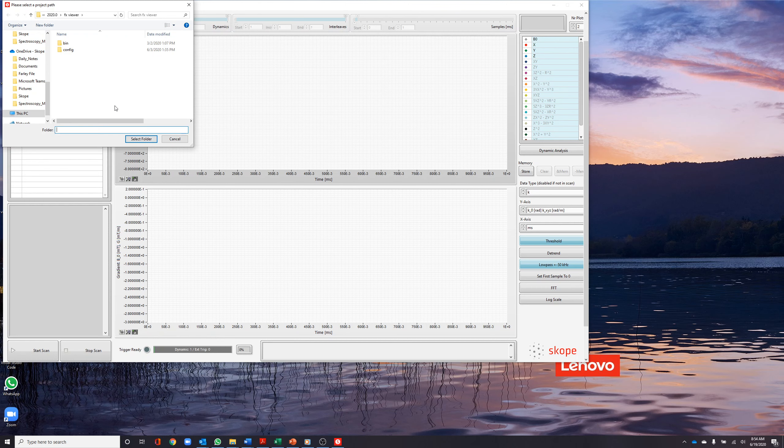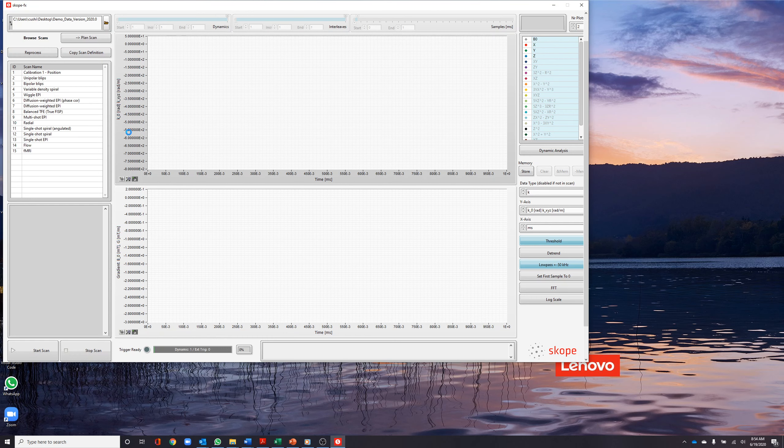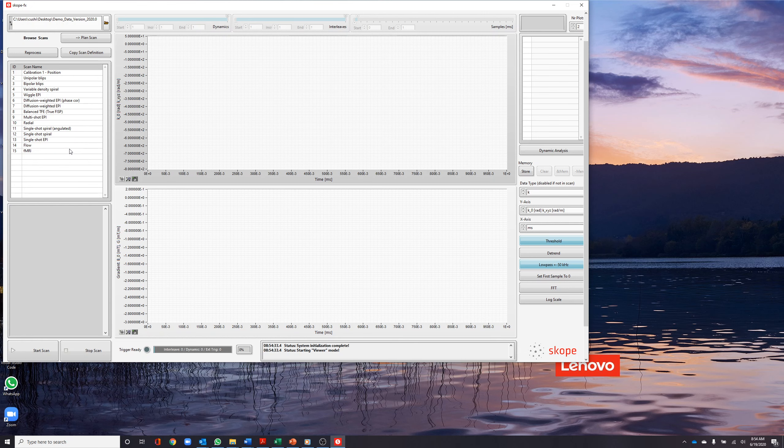When you start ScopeFX, you will be prompted to select a project directory. This directory contains one or more data sets which you would like to investigate. This is also where new scans are saved.